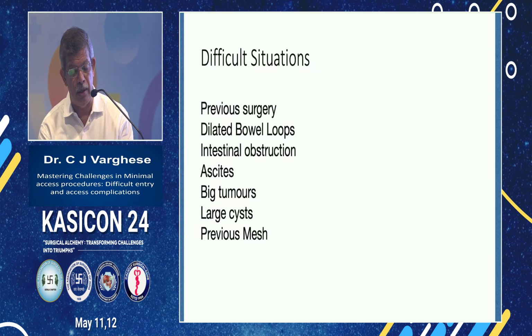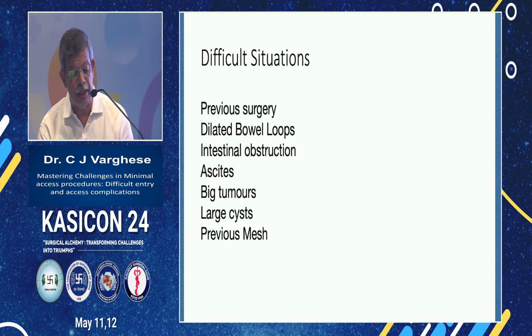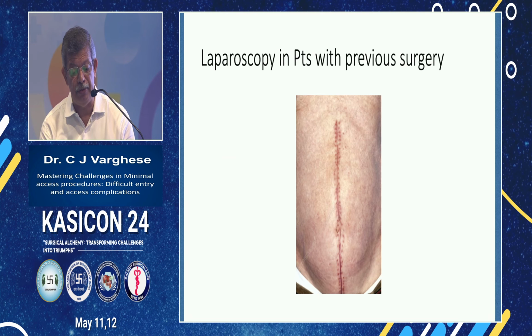So, difficult situations: previous surgery, dilated bowel loops, intestinal obstruction, ascites. With ascites, the fluid can come back into the insufflator. Then big tumors, large cysts, you have to make sure you do not directly puncture into them, and previous mesh entry could be difficult.